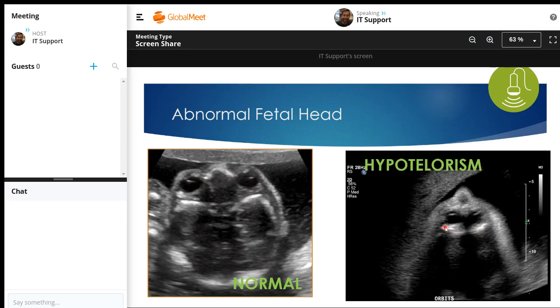And then we're looking at the fetus in the same way. So the nose here, eyes are here. They're so close together that it almost looks like they are connected, which they could be. Eyes don't have to be separated; on the extreme end of hypotelorism, they can be connected in the middle there.